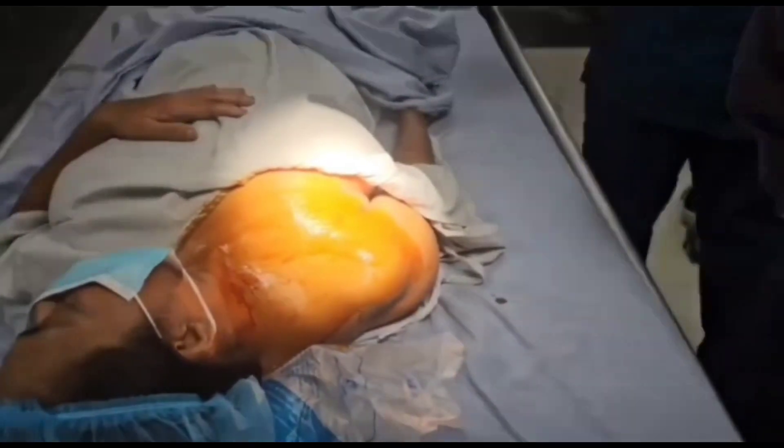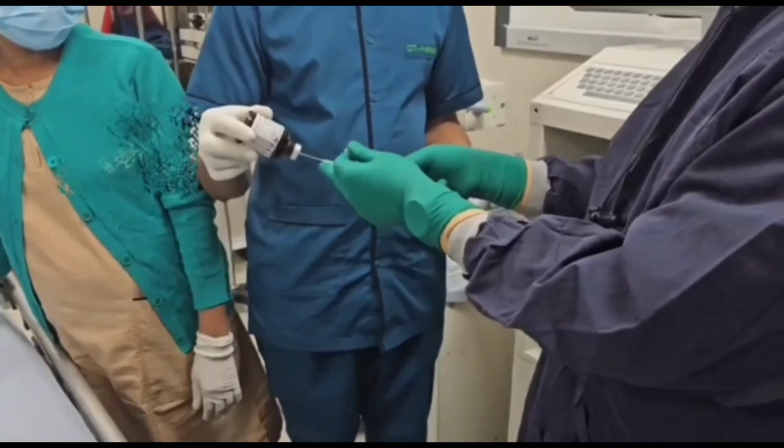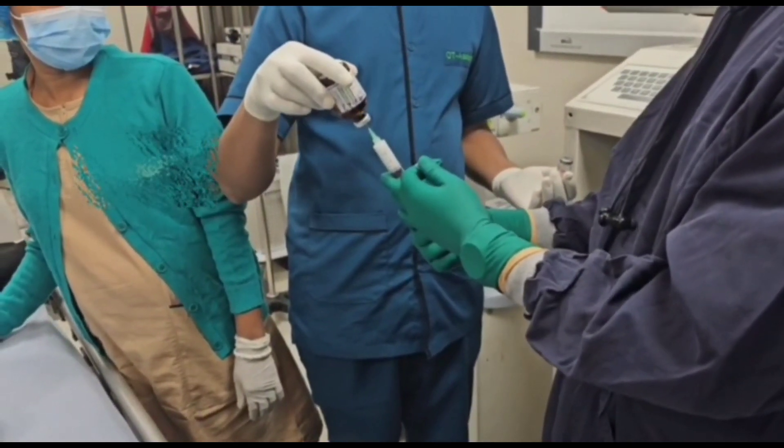First we prep the skin with Povidone iodine solution over the area. Then we take the local anesthetic for numbness of the puncture site.